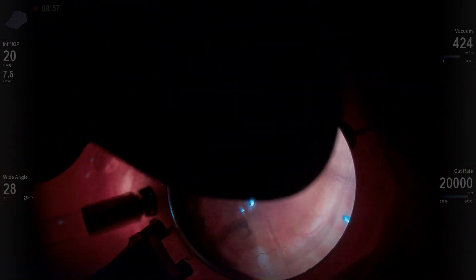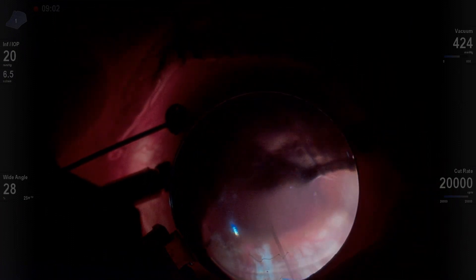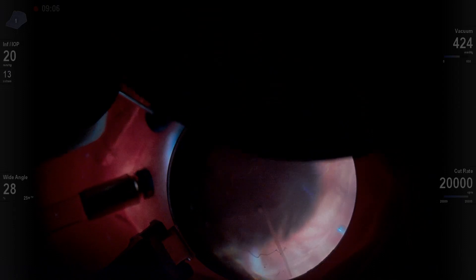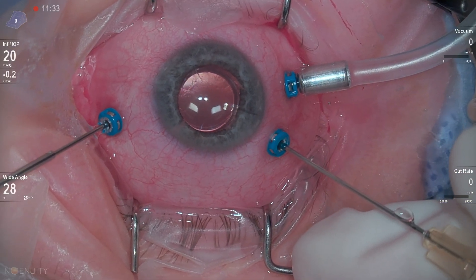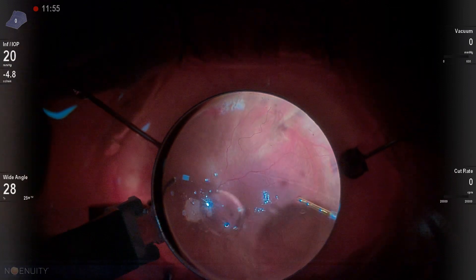So I'm going to do some anterior vitrectomy. I now have that third hand — that perfluoron in there stabilizing the retina — so I can do some additional vitrectomy, shaving down peripherally just to try to eliminate as much vitreous as possible, and also seeing if I can identify any additional breaks as I shave over those areas. I'm going to go back in with the dual-bore cannula and perfluoron and fill the eye up almost completely with PFO.